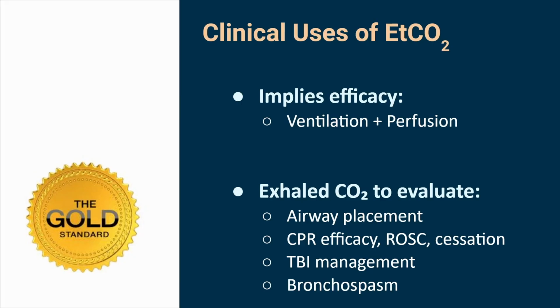The implication there is sometimes people are like, oops, it dropped below 10, they're not coming back. And I'm like, oh, okay. The difference is whether they ever got above 10 or not. That is the big thing. Now, I am okay with you saying, look, I'm going to just call this right here. I've got a guy who's been at 10 for 20 minutes. I'm like, cool, call it.